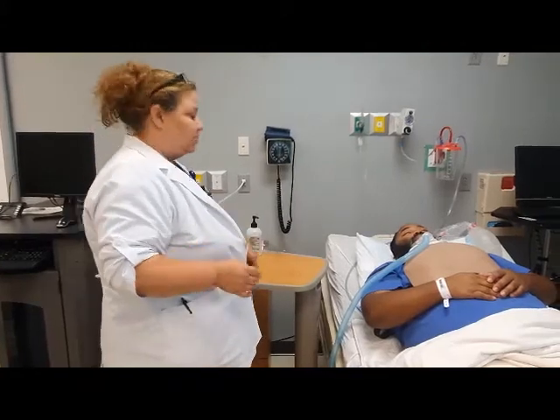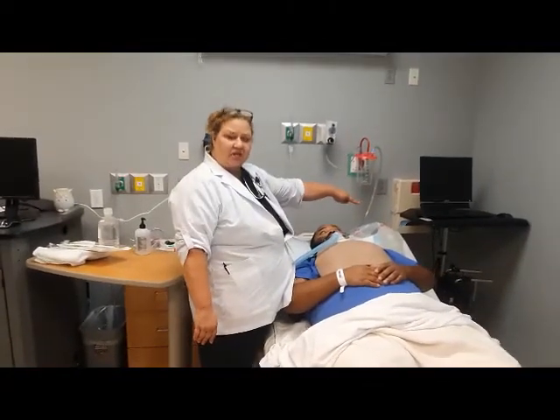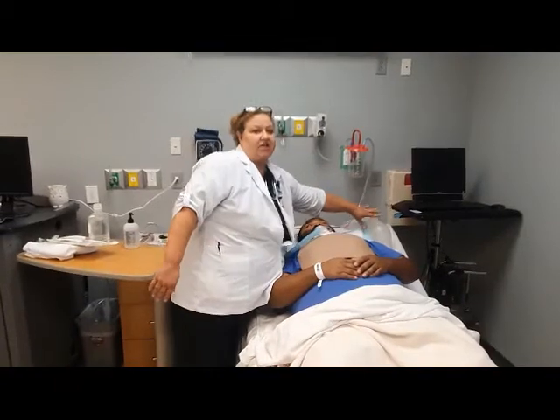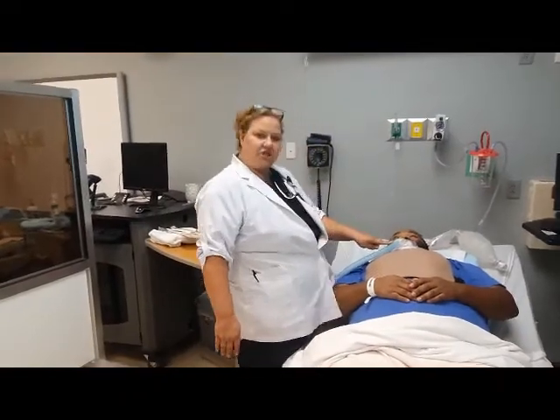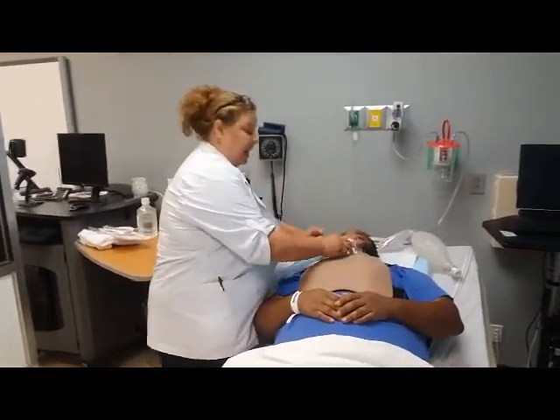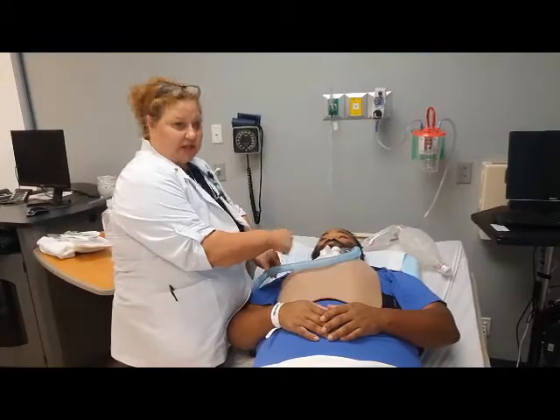Now, as I've said, you'll have a bag mask. It will normally be up here at the top, but I'm putting it on the other side of the patient so that my assistant will not be in the way, so they can take this and bag the patient in just a little bit. Also, the oxygen that's right here, my assistant will take and move to the side with gloves on, so I'll be able to do the procedure that I need to do.